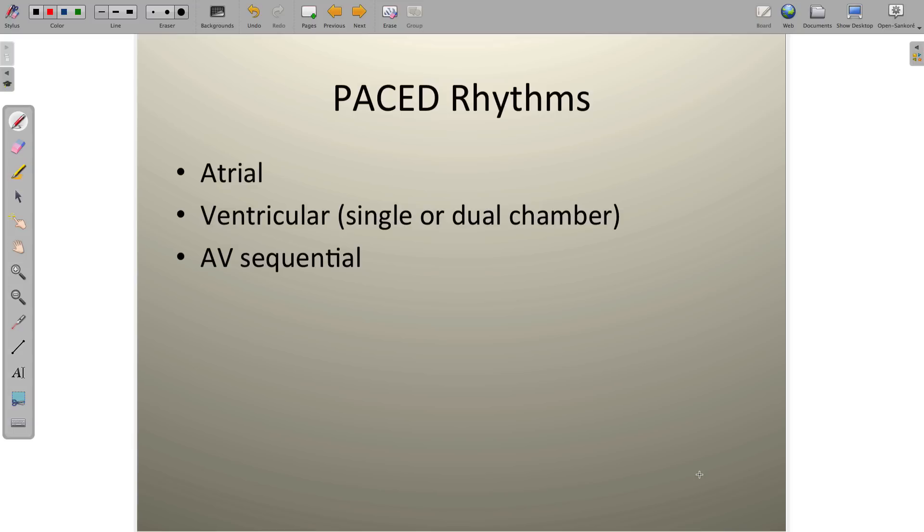Anywhere that there's a pacemaker inside a patient, we're going to be able to see pretty specifically which chamber it's in — whether it's in an atrium or in a ventricle or in two ventricles — and we're going to be able to determine the type of pacemaker just by taking a look at a few things.